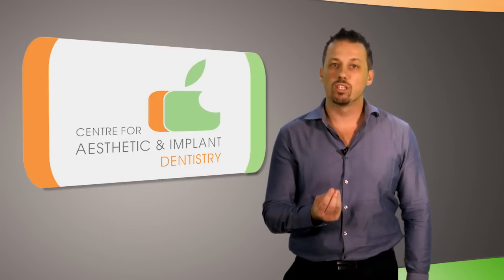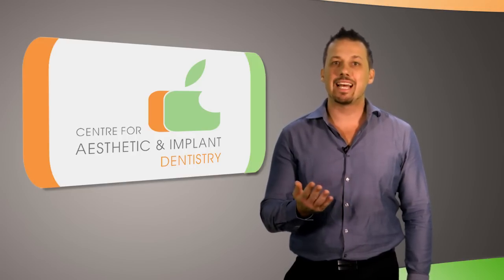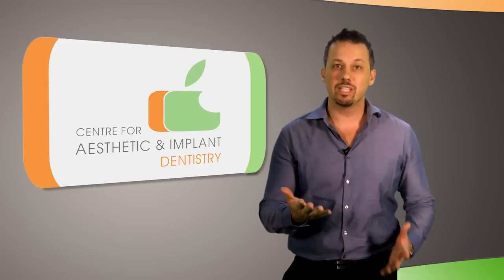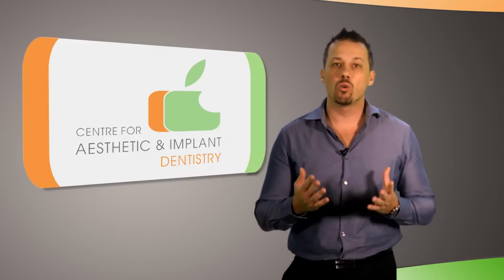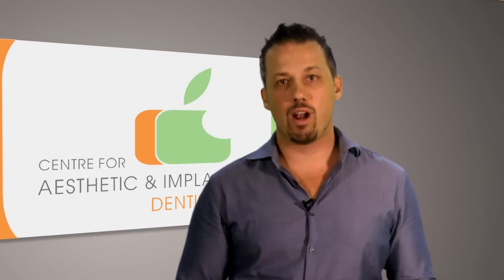This is called socket grafting. Another type of graft is when the graft material is layered on the outside surface of the jawbone to improve its width. This is known as onlay grafting. But perhaps the most common type of grafting is the sinus graft.